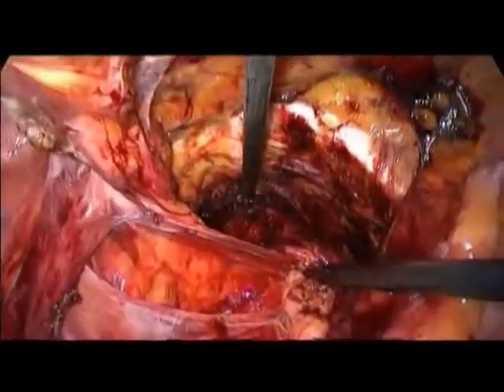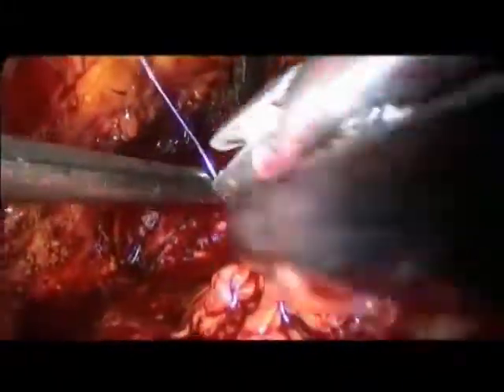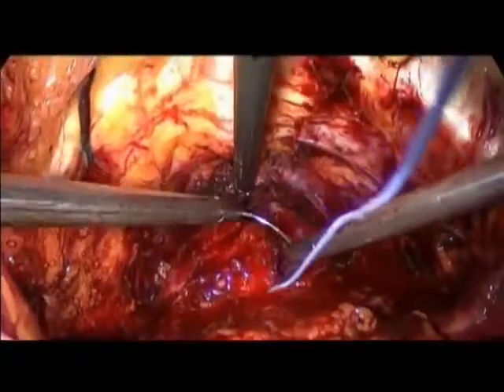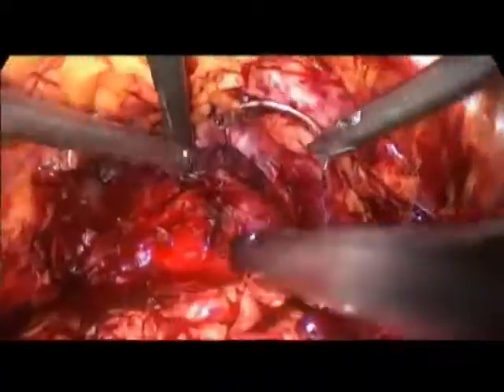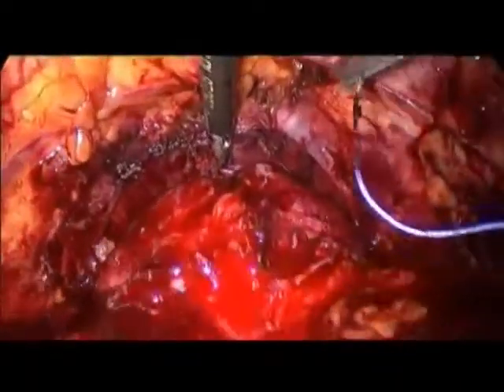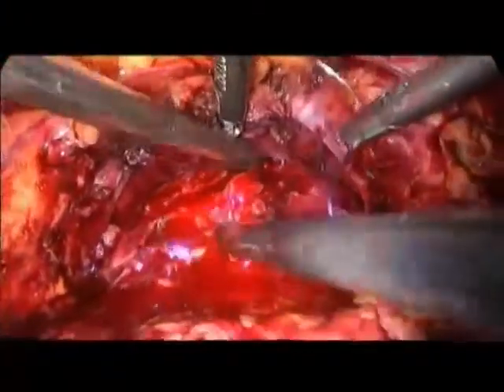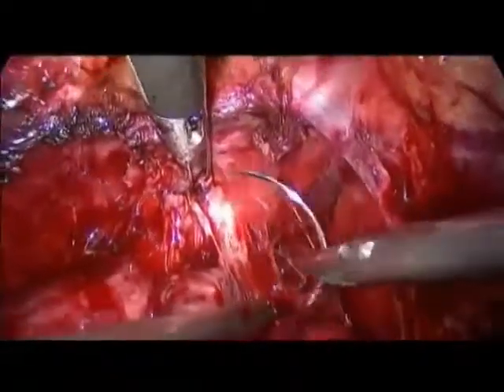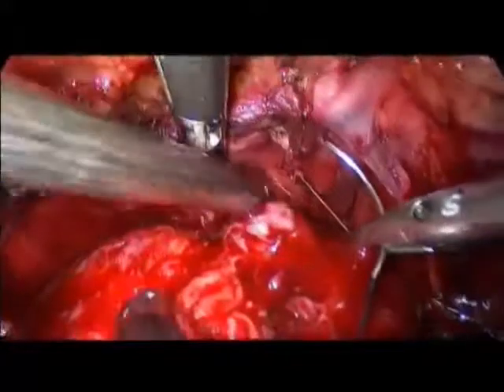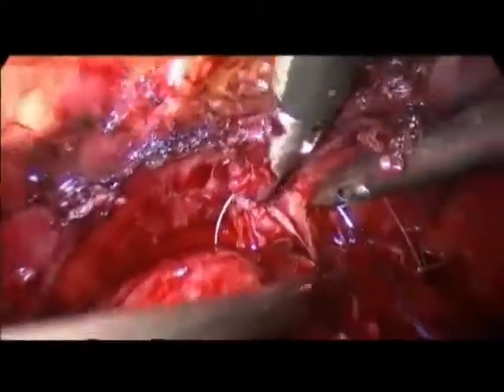So we will now answer the question about the stitching. You see that all the Santorini is squeezed in the forceps, and the length of the forceps, as you have seen, is convenient to end just at the anterior aspect of the urethra. Sorry, I have to move my trocars a little caudal. And in the classical tying of the Santorini, I was always wondering about the depths of the catch here when this is still intact. So here, there is no question, you just catch the structure at the tip of the forceps. This is one catch caudal.